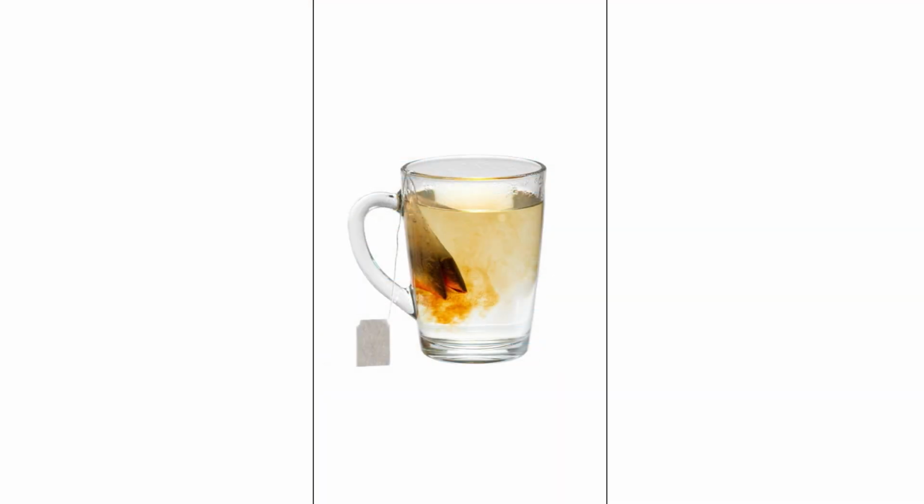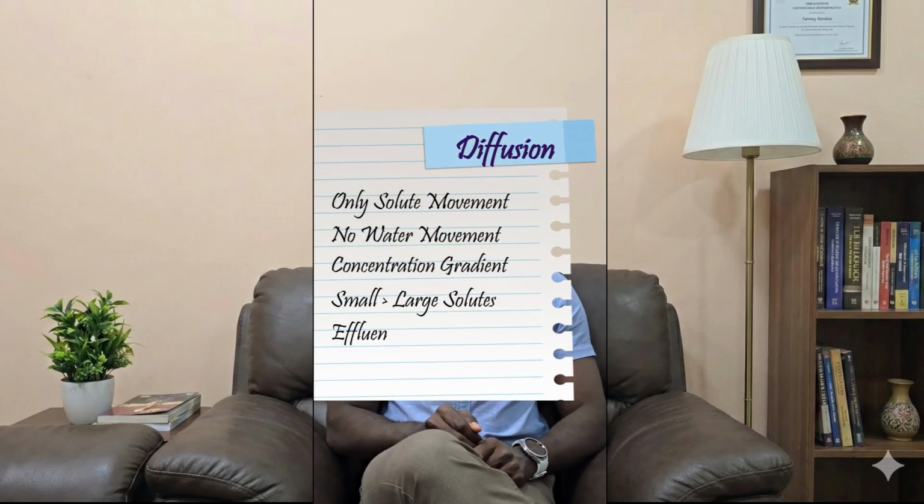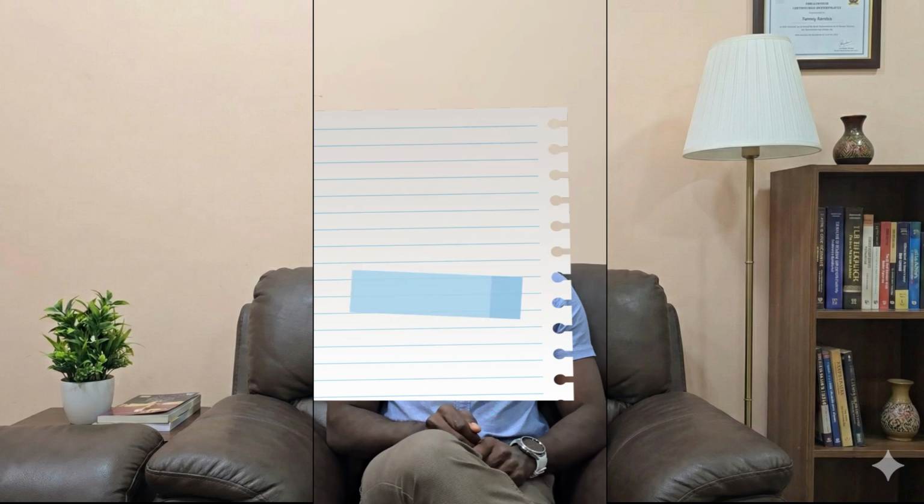And just like the water outside the tea bag never becomes as strong as the tea inside with a limited contact time, the toxins in the used dialysate, that is, the effluent, never reaches 100% of the blood concentration. So now let's move on to the second concept, convection.